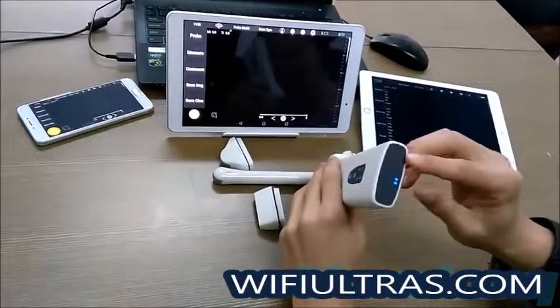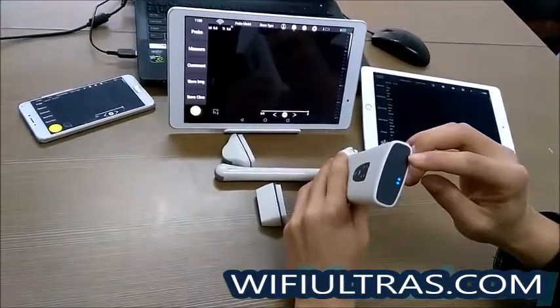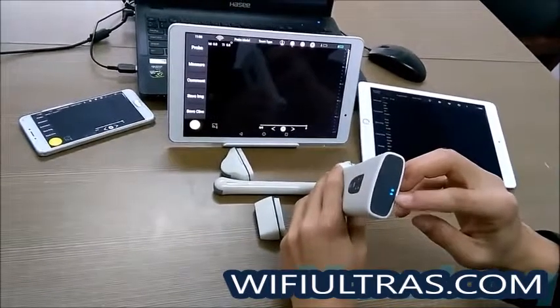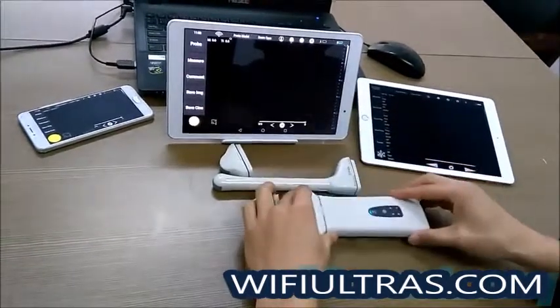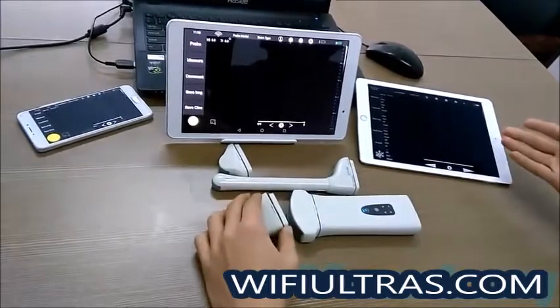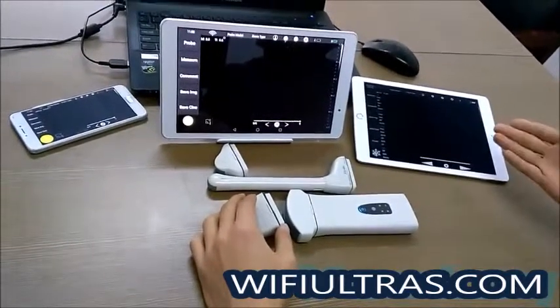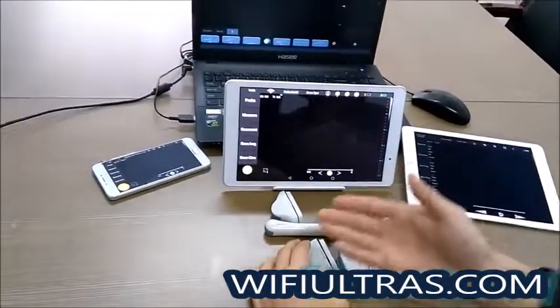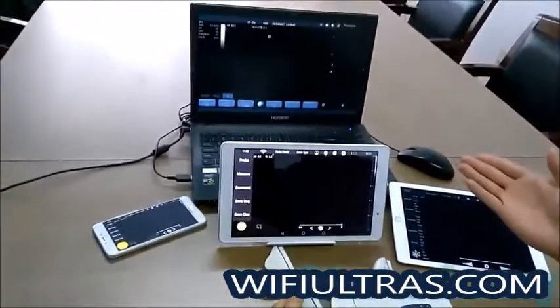This is the charger and this is the indicator light for the battery. Here are the terminal devices that we support: the iOS system, the Android tablet, Android smartphone, and also the Windows PC.